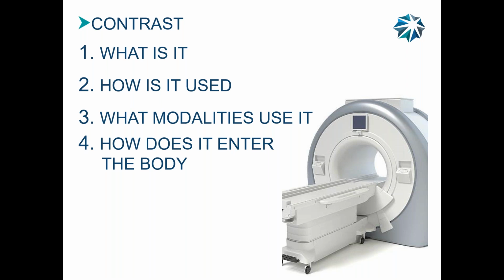SMPTE pattern. Who's worked on a monitor or television and they pull up a SMPTE pattern? It's a pattern that you put up there that shows the different shades of gray. Okay. Anyone here worked on Mammo? They have a phantom that they put on there to show the different shades of gray.